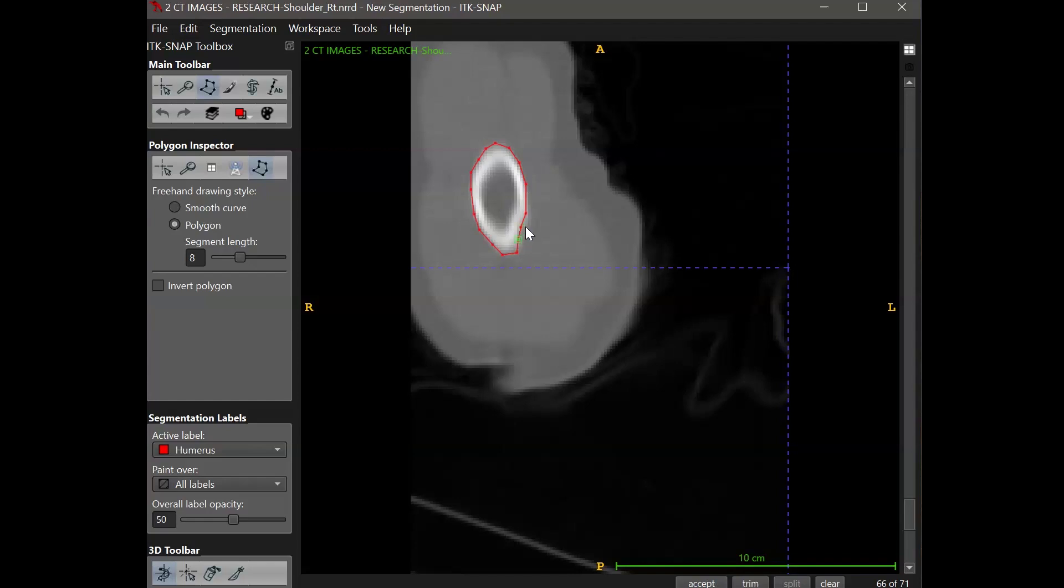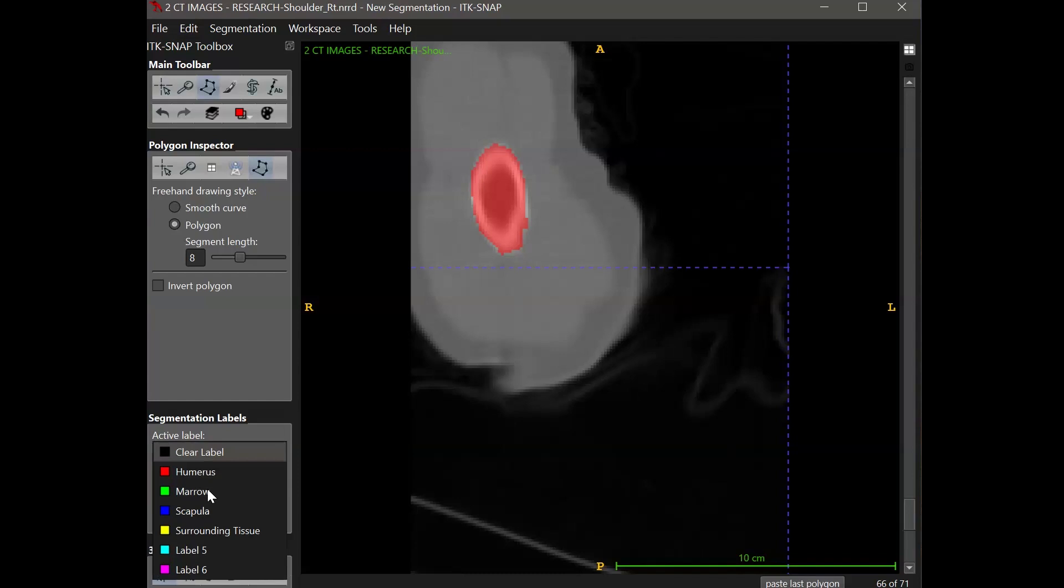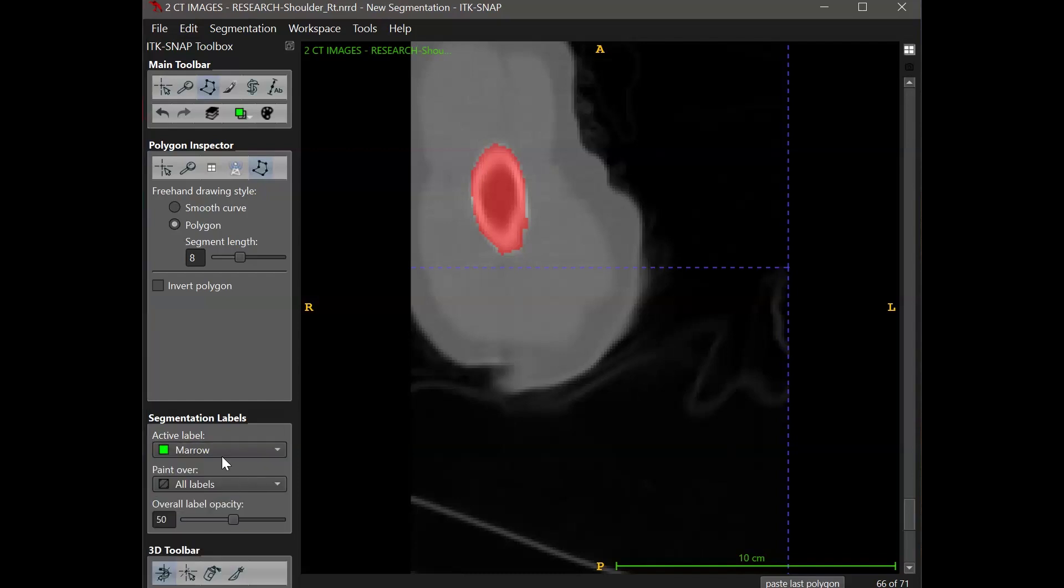For the humerus, in a CT image such as this, the pixels are going to appear bright white. So I'm going to select the white elliptical sort of cross-sectional region of the humerus. With the polygon selection tool, it's going to fill it in.